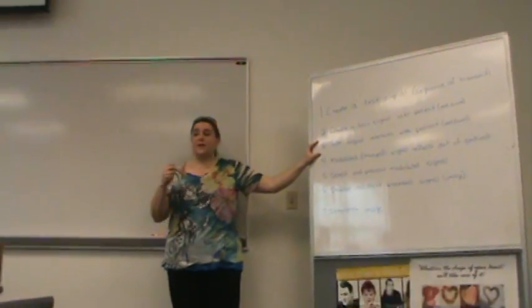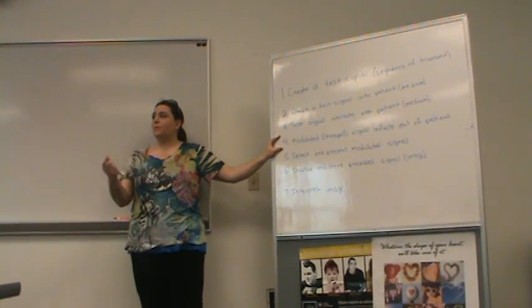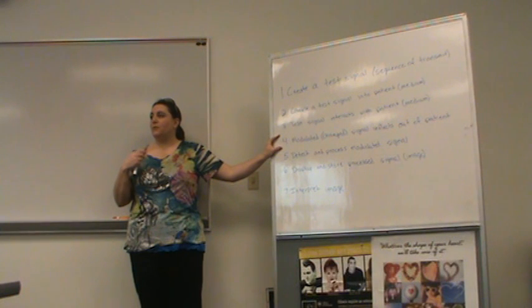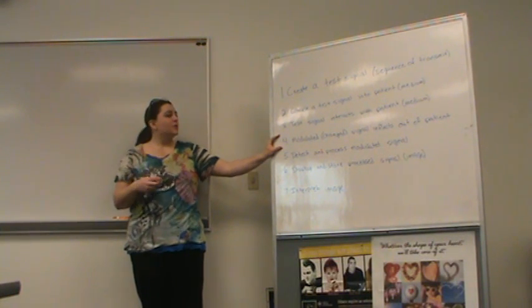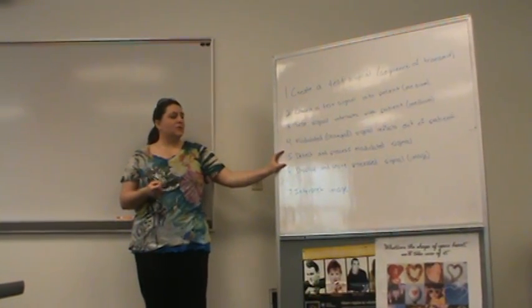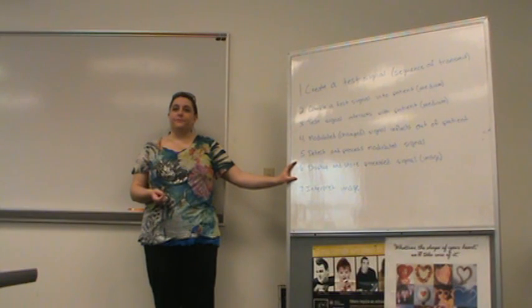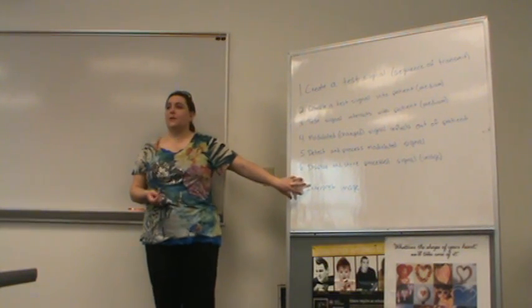The signal interacts with the patient, and the patient changes it. Remember, what we send in is not what we get back out. If it was, then we wouldn't have an image. So then the signal is changed somehow. So then we have to detect those changes and process those changes, and finally we have to store them. And then eventually we're going to end up interpreting the image.